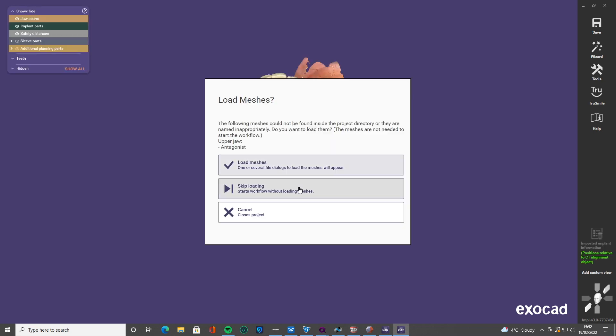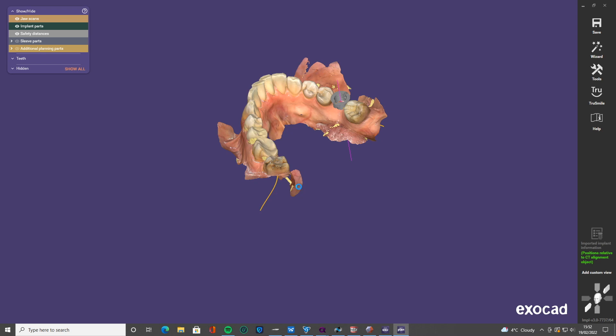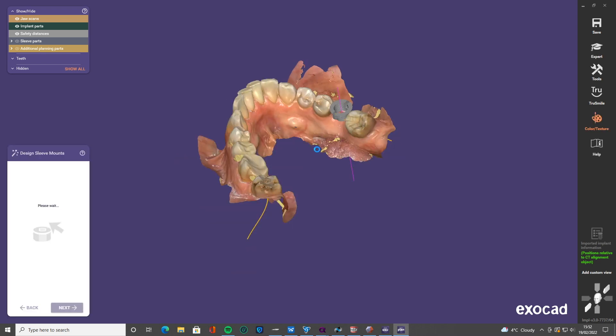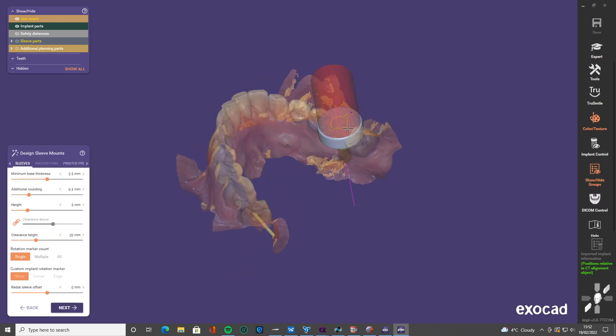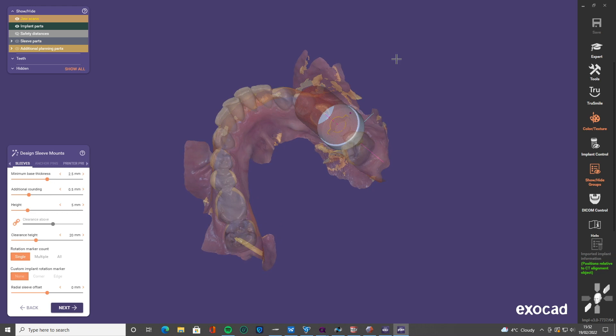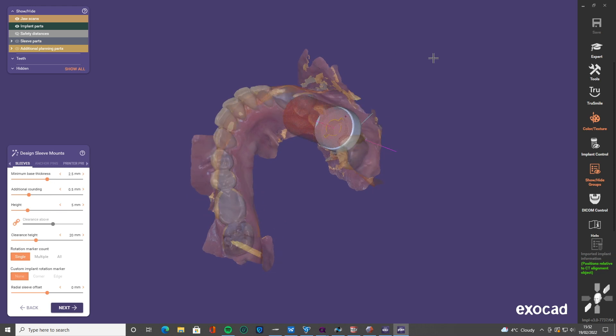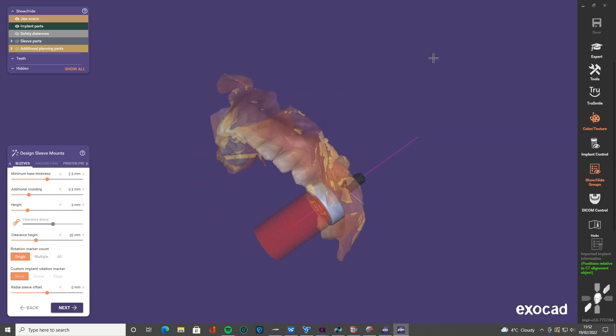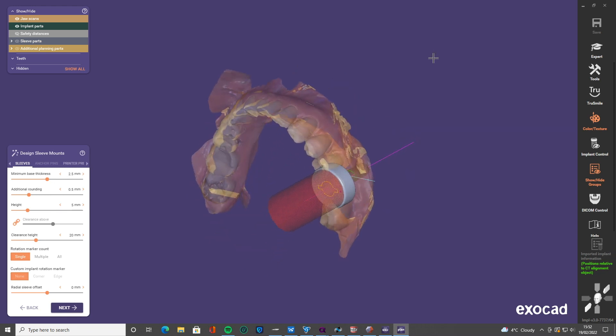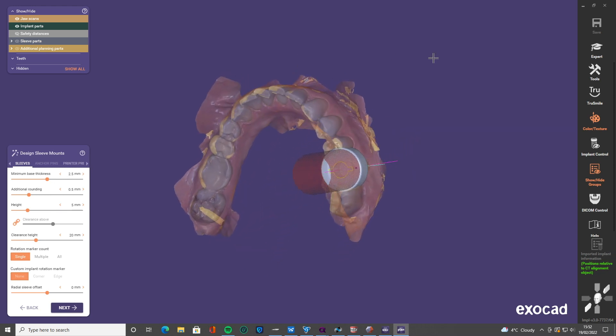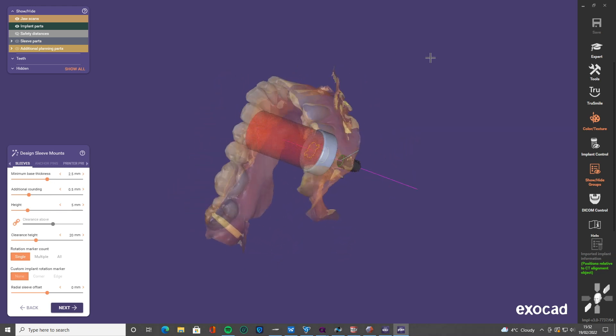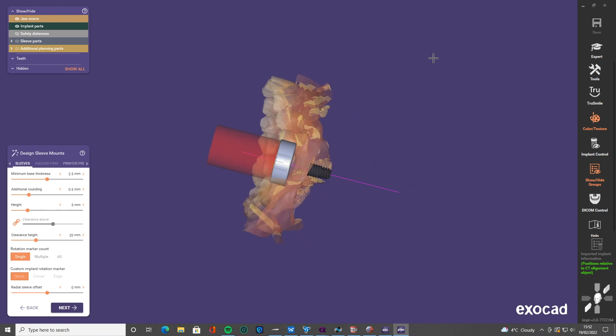Do we need to bring in the antagonist? Not for the purpose of this. Now we're not designing a crown, that's okay. So here we go, we've got the sleeve mount that's over the top of the implant. It brings it in with the usual settings.